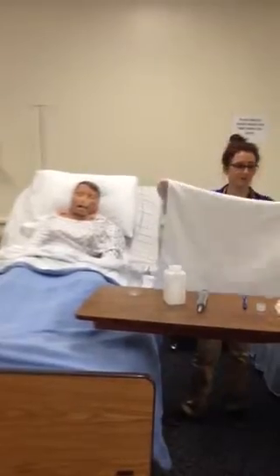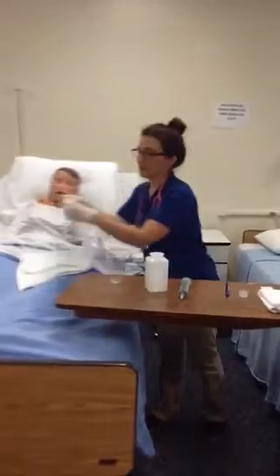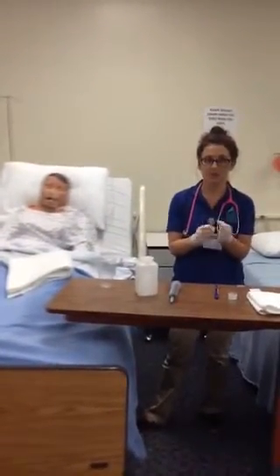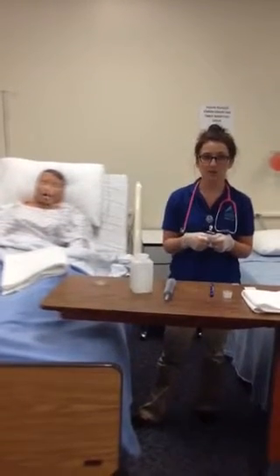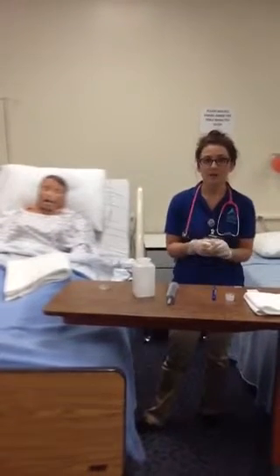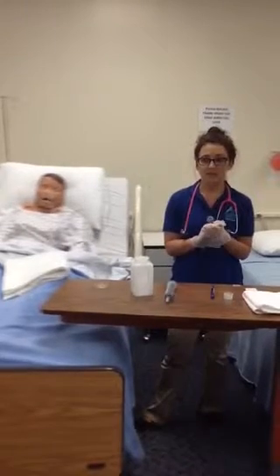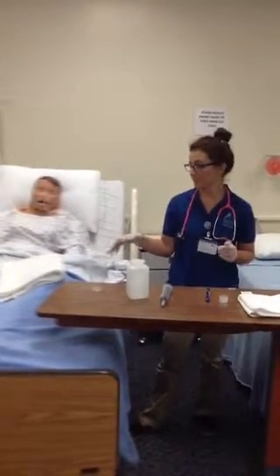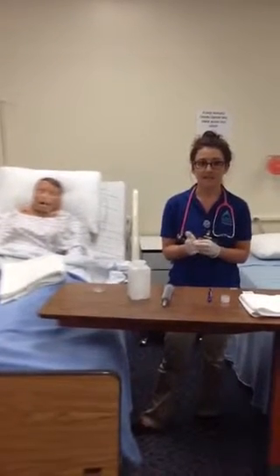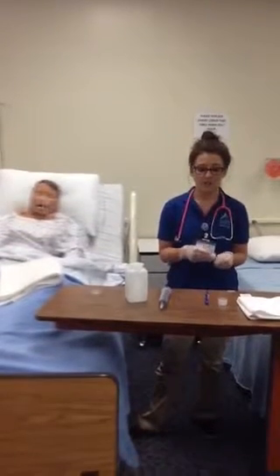And now I'm going to state the documentation for irrigation, which would be the type and amount of the irrigation solution, the contents that we pulled out, along with the amount of any extra gastric secretions that may have come out with it, the client's response, the time, the date, and the nurse's initials, and any instructions given to the client I would also document.